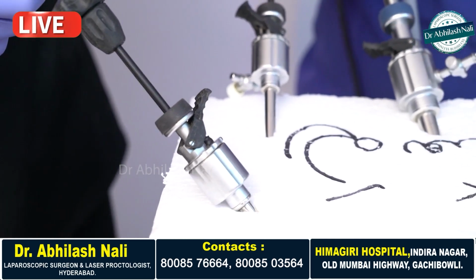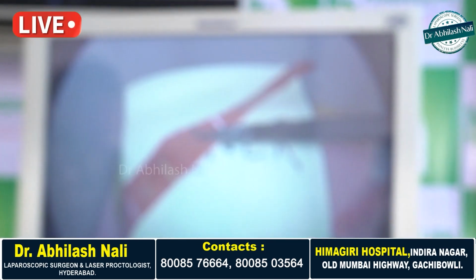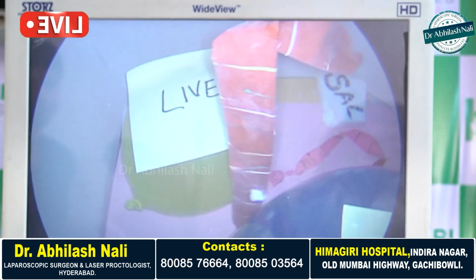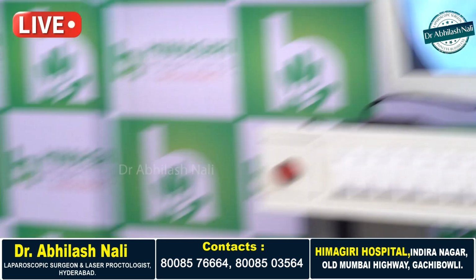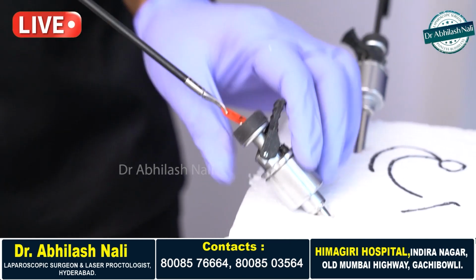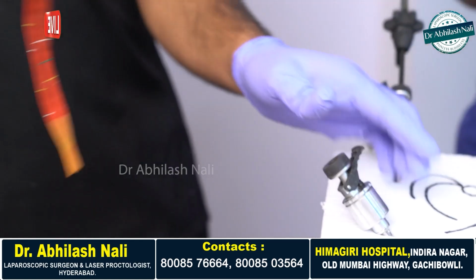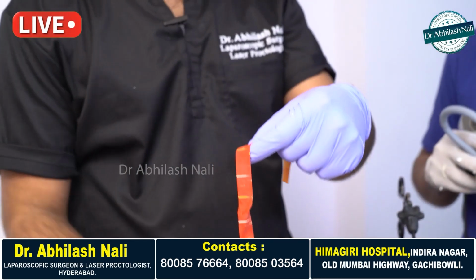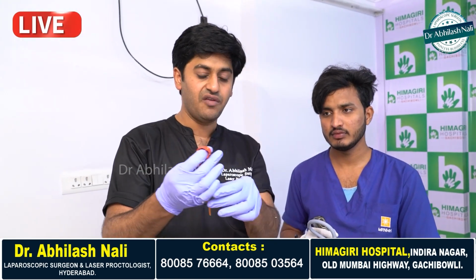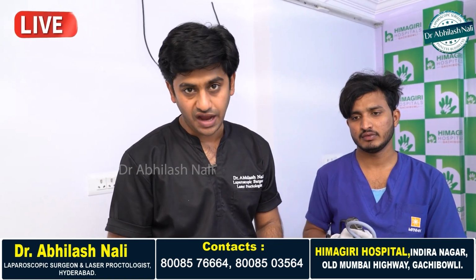In the same way, if there is a worm in the abdomen and we want to remove it, instead of cutting open, we can catch it with laparoscopy and remove it from inside, as demonstrated. Without cutting, we will be able to remove the complete worm this way. Through these small holes only, we are able to remove even such long worms, and this is the beauty of laparoscopy.